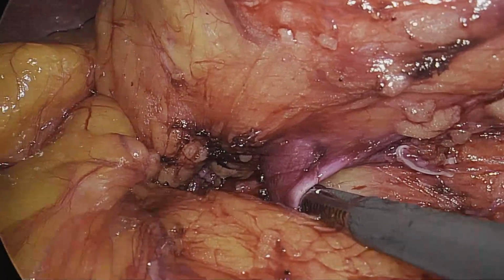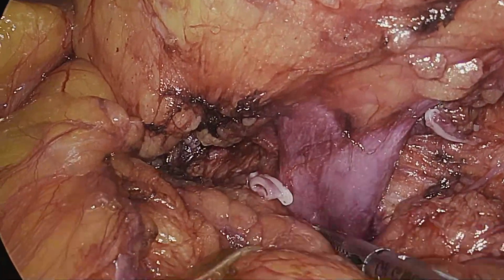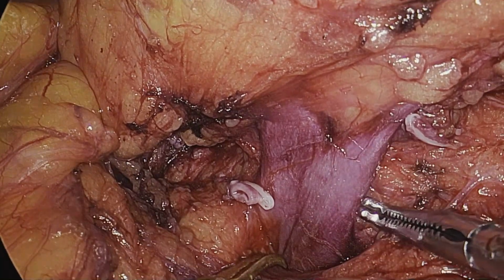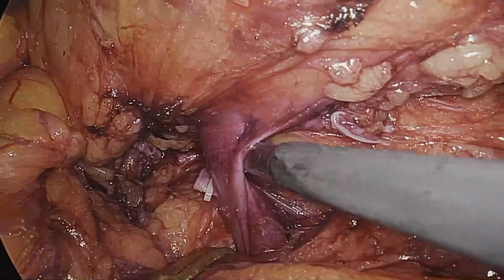The renal vein here is being encircled. A right angle instrument is being inserted behind the renal vein to encircle it so that later it can be clipped well.